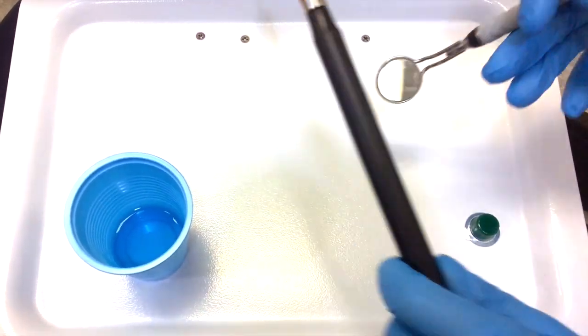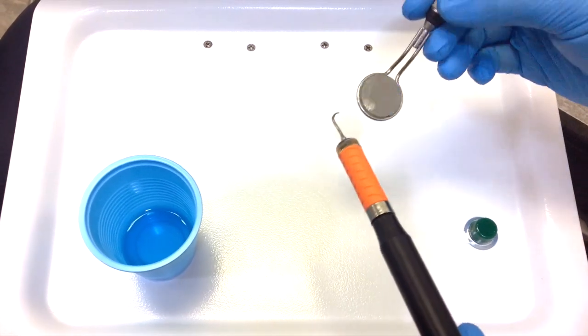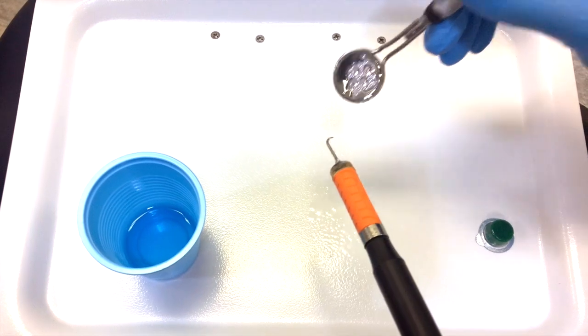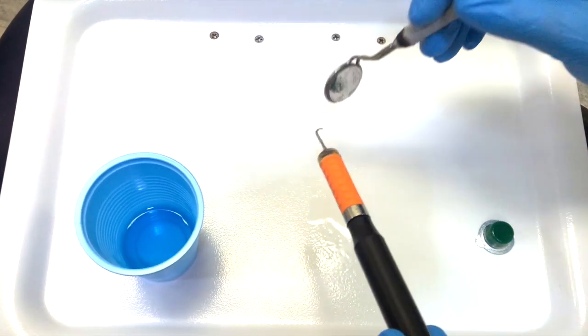The first one is, if you see, if you don't use these techniques, the water tends to really bubble and make droplets on your mirror.